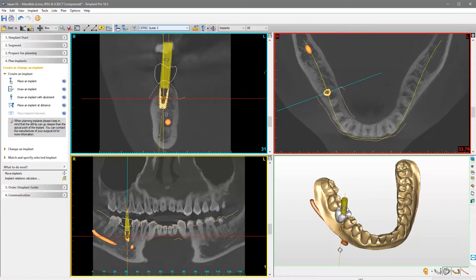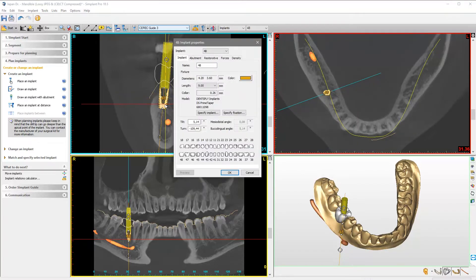The implant is now visualized in your images. In order to add additional information to the implant, double-click it to access its properties. Here, we will indicate the tooth position. If you need to change the implant diameter or you want to use another implant type, click Specify Implant.